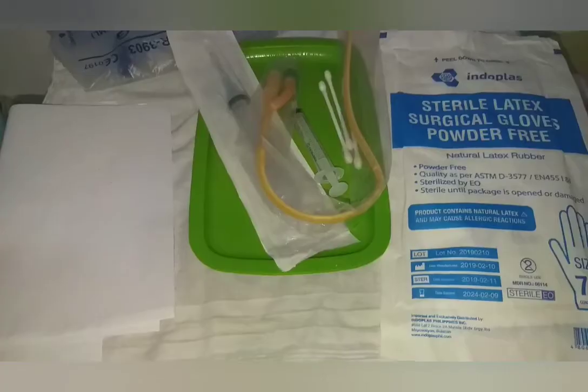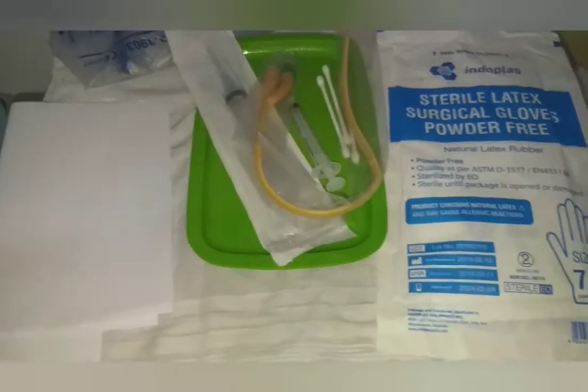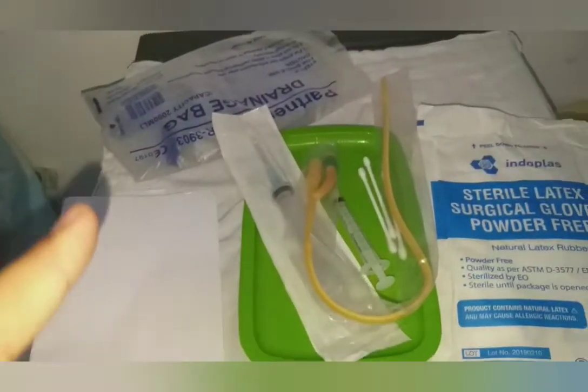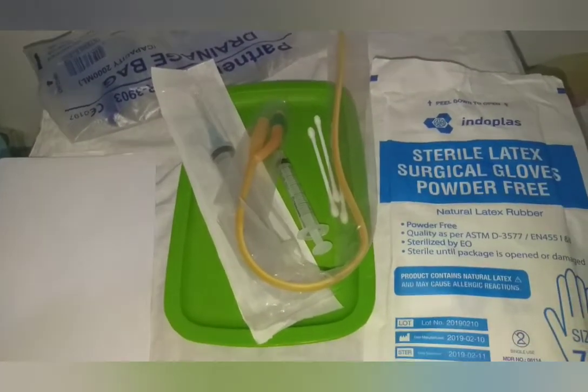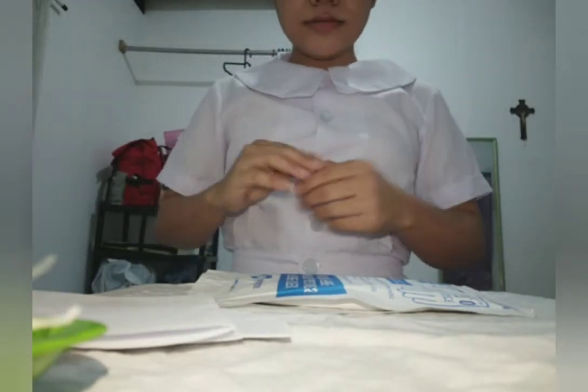During the insertion, we have to maintain the sterile technique. On the sterile field, I have all my materials: the sterile gloves, catheter, syringe, and drapes, and I have a drainage pack already on the sterile field. So first of all, I will put on my sterile gloves.